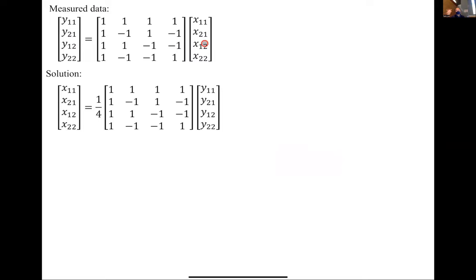You just plug this into MATLAB and you'll see that this is the case. And so it means I can solve for my object from my Fourier coefficients. So that's essentially what we're doing. Like in your homework, when you took the big object, you took the Fourier transform and then took the inverse Fourier transform, MATLAB is just basically doing this for you.